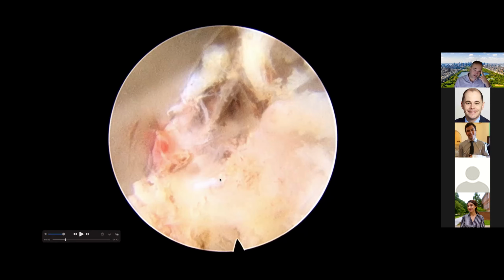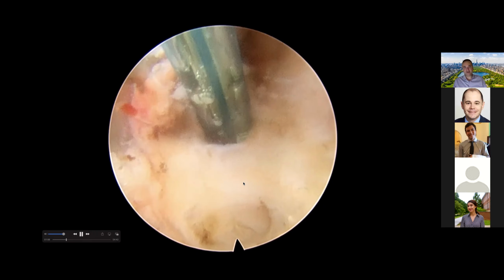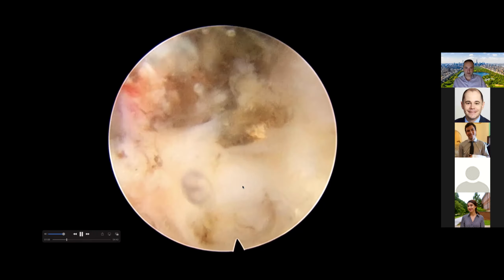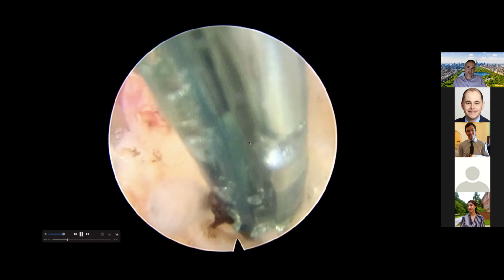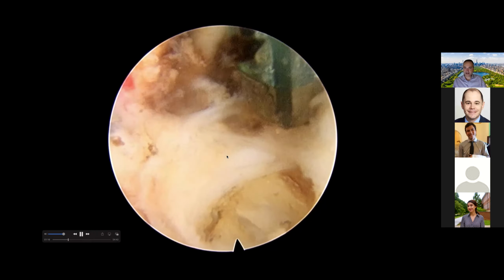So it's a nerve that we very commonly resect or ablate in clinical practice to treat low back pain. And that tiny nerve was in our way to treat the pathology, and we felt that we needed to resect it, otherwise the manipulation of the instrument would have caused significant damage to the nerve, and probably would have caused neuropathic pain. So that's why we selected to resect it. And probably, by resecting, we would help the patient with her back pain as well. And here is the disc herniation, and we're buzzing on it to see it a little bit better and to shrink it a little bit.